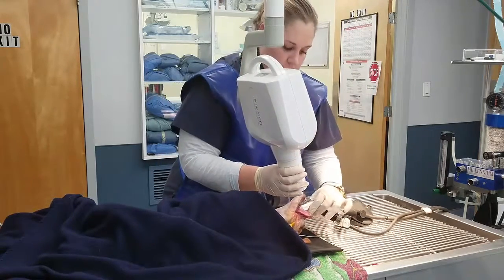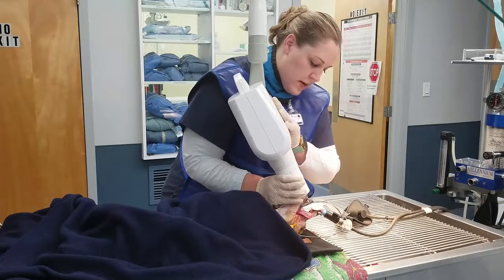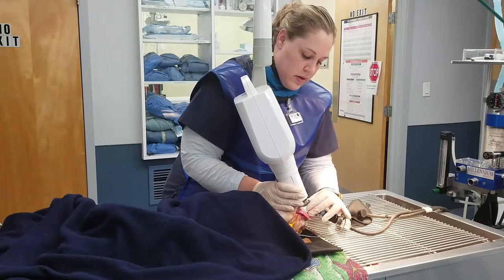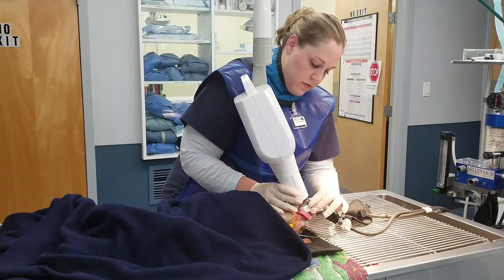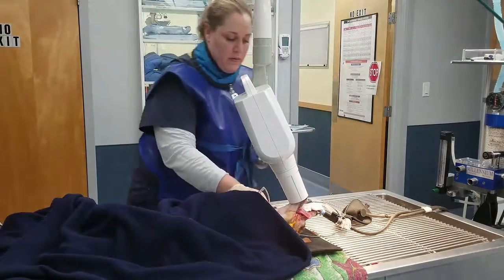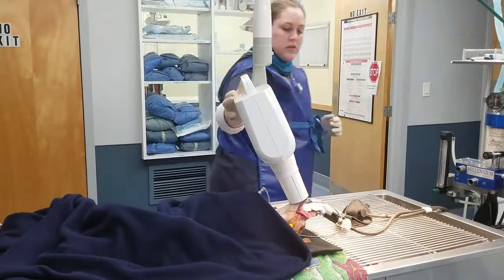So what I've done is I have my patient set up for the shot. I have the plate in place for the 404 tooth to be shot, and the plate is lined up in position for the root. I have a hypodermic needle on that side in case we get both teeth. That way we can ensure that we have that one tooth marked, because that's the tooth of interest.